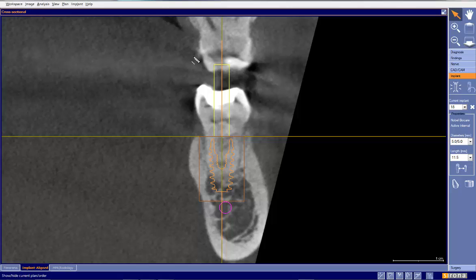The bigger question I have on this particular case is, here is my bone level there. Here is my bone level there. So we'll say it's about like so all the way around. So is this enough depth to accommodate for the bone loss? I have a tendency to believe that this should be pretty close.